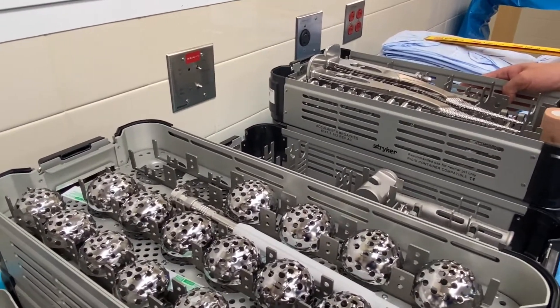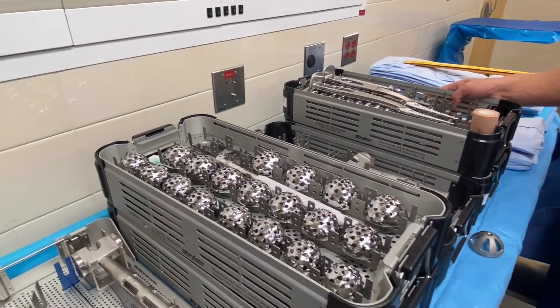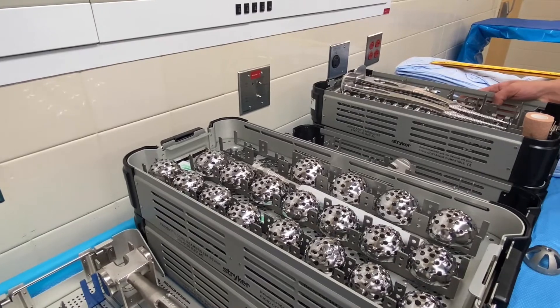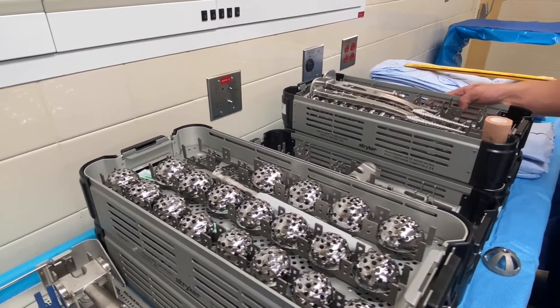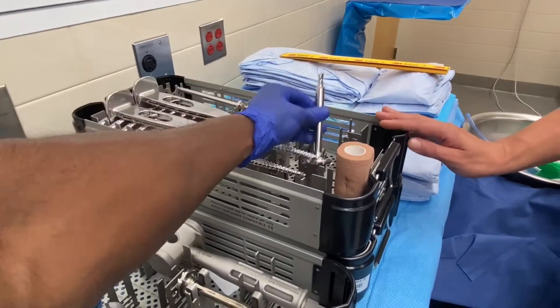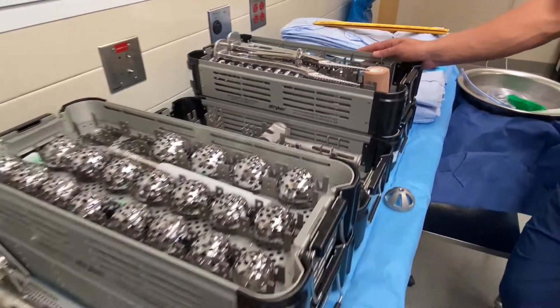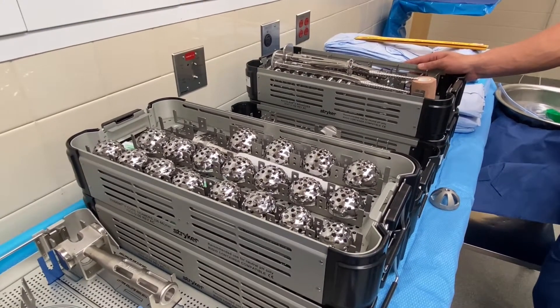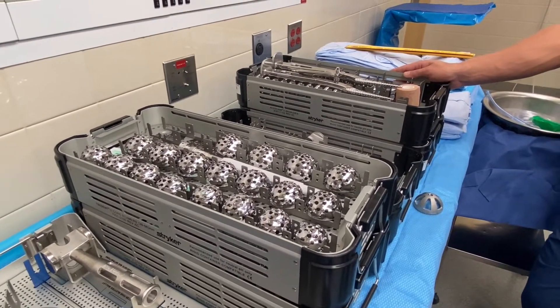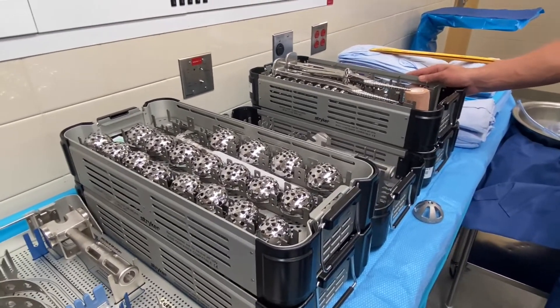Do you have the 133 here? Yeah, beautiful. Normally the default is 127, but for a little extra offset I'll ask for the 133. If my cut is kind of off and I'm trying to make it look good on the x-ray, I'll ask for it — I don't always use it but sometimes.